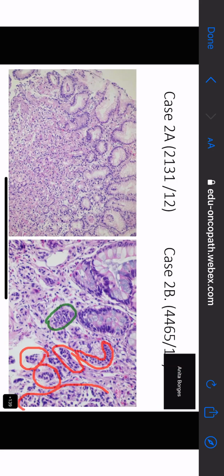All right. So there, you have nests over there, and they have these very dense looking nuclei. The cytoplasm is not very conspicuous, and so you can't say anything. On the other hand, this is sitting right in the lamina propria, along with lots of, do you see the eosinophils? Yes, ma'am. There are plenty of eosinophils over here, and on the left hand side you can see absolutely normal fundic body type gastric mucosa. There's nothing wrong with the body mucosa on the left hand side.